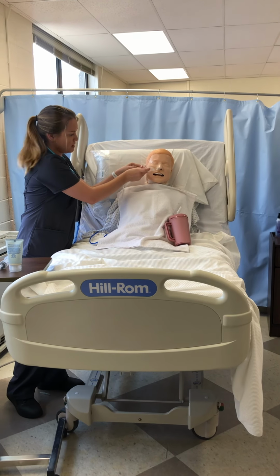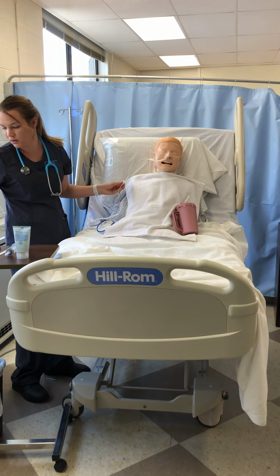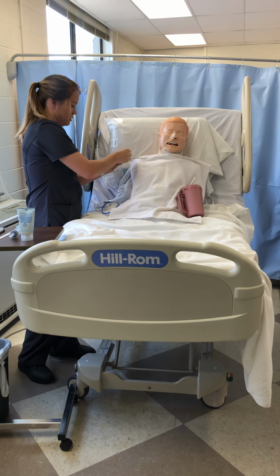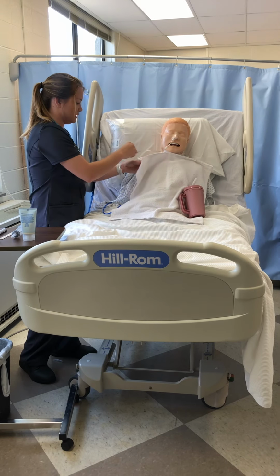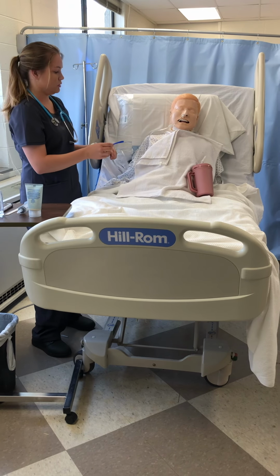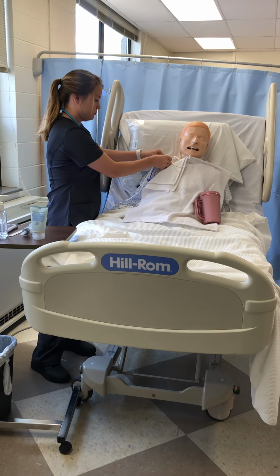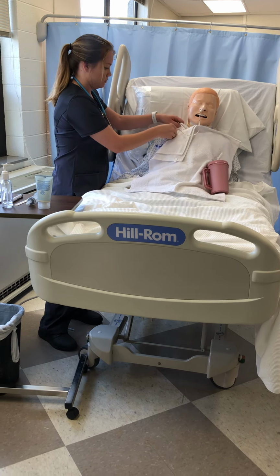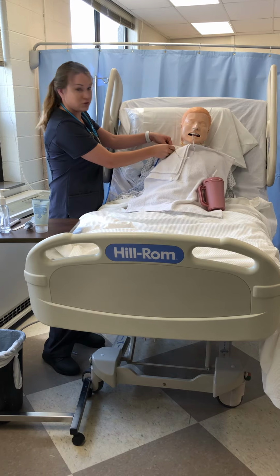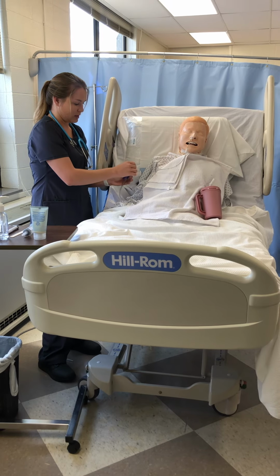I'm going to remove it from his face. And attach it to his gown. And then you could hook this up to a tube feeding or suction. This would be attached to his gown, and then I would hook it up to tube feeding or suction, or in this case I'm just going to clamp it.